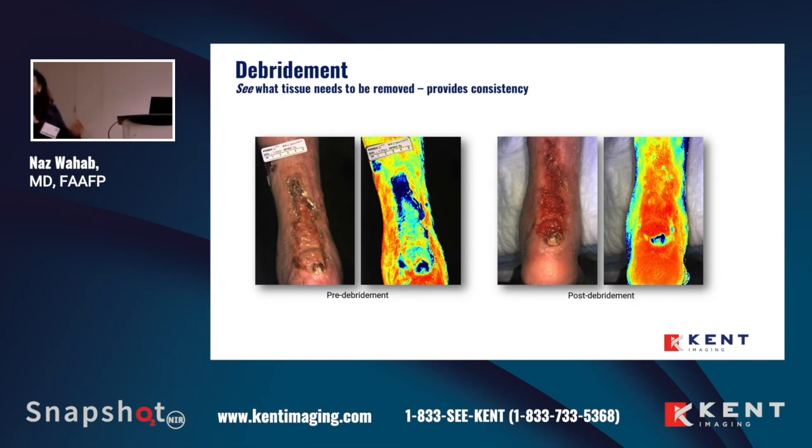Post-debridement, so it can really guide you to continue to debride. How much do you need to debride? And where do you need to debride? That could really institute greater blood flow. It's very, very important. And you can see it as a very obvious pictorial.